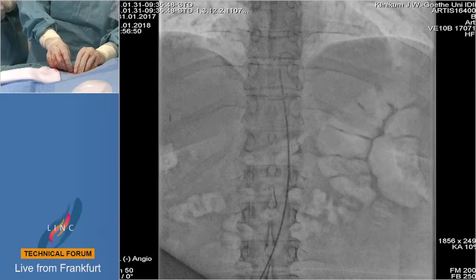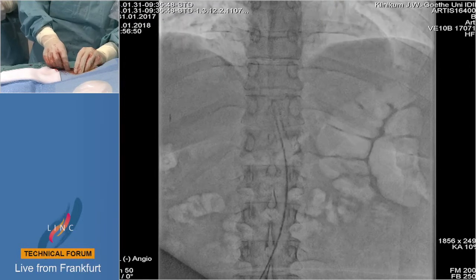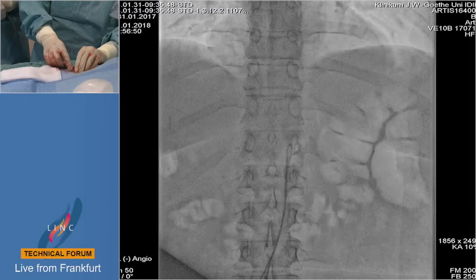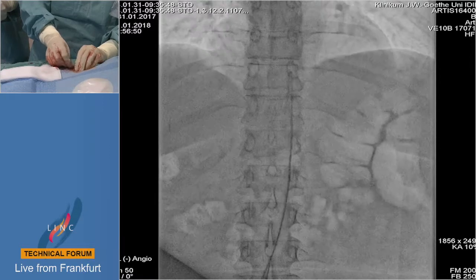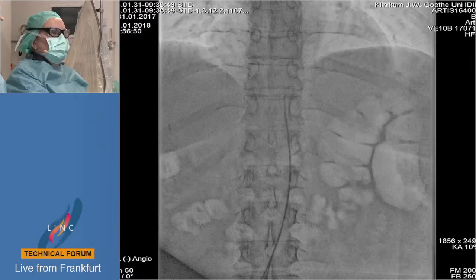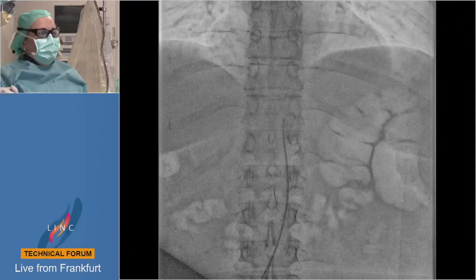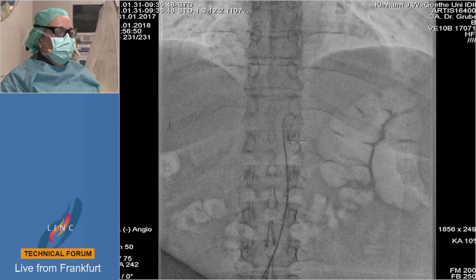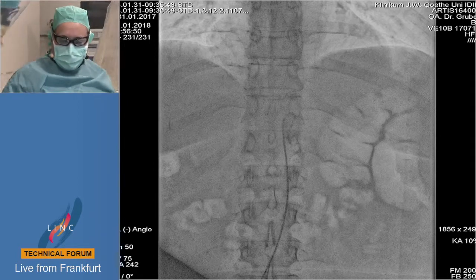For the initial therapy, did you perform a mono chemotherapy in conventional TACE? Because Frankfurt is very strong in the combination with 2 or 3 chemotherapeutic agents in HCC. Can you stress on that point, please? The chemotherapeutic agent was mitomycin C, the embolization agent was lipiodol, and the technique was a sandwich technique.